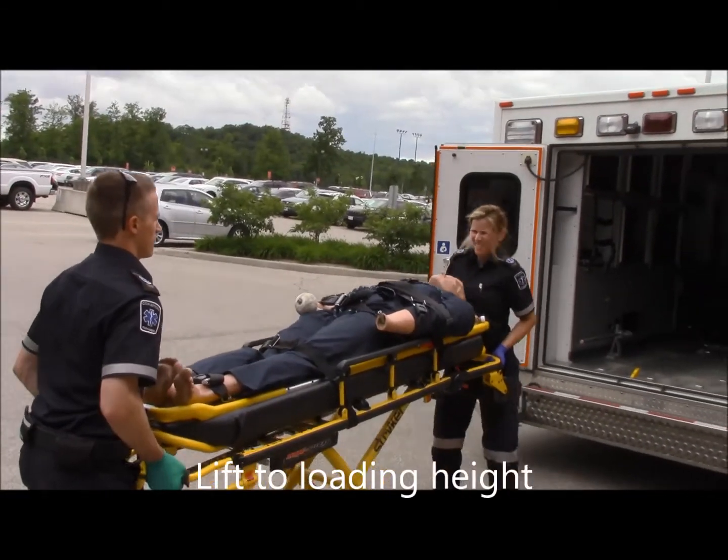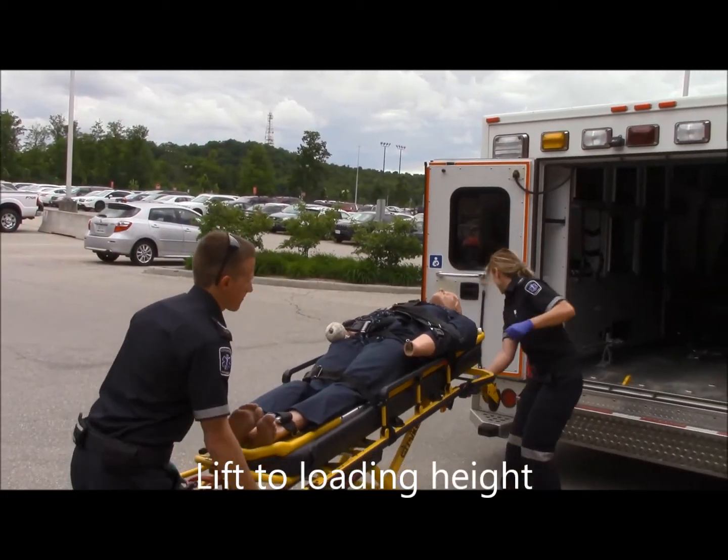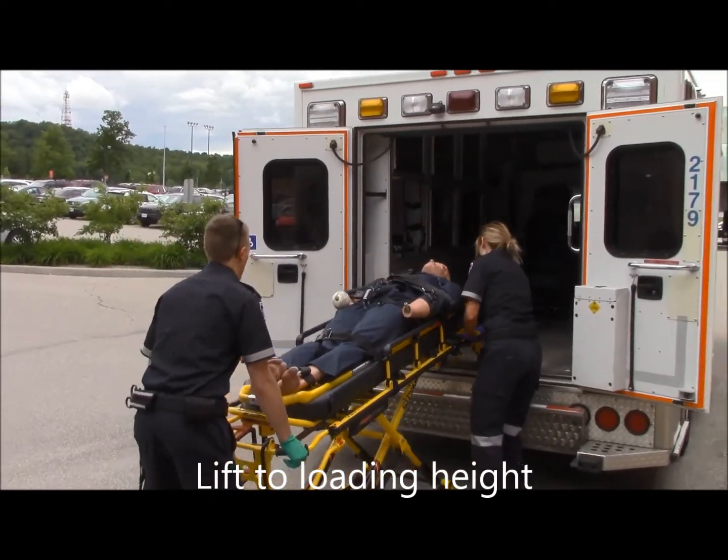The fifth and final part is the ambulance load and unload. You're going to begin by raising the stretcher to loading height, and you're going to adhere to all the safety practices that you have learned for this process at this stage of the test.